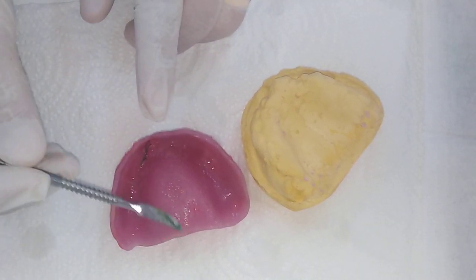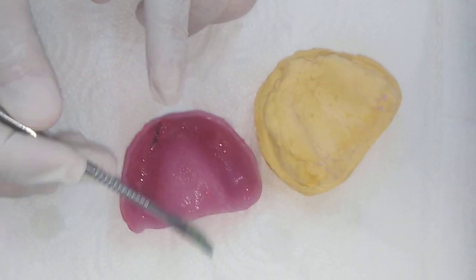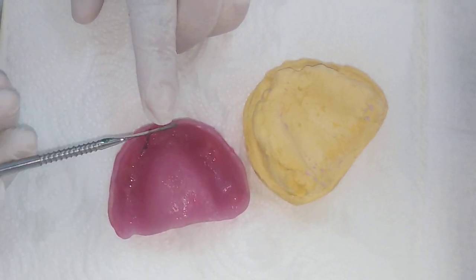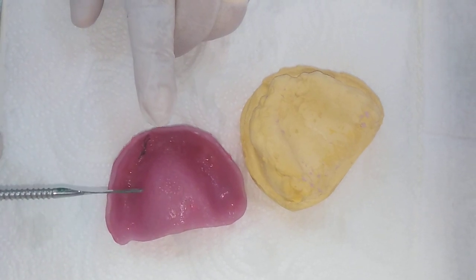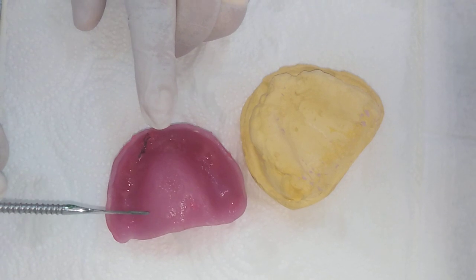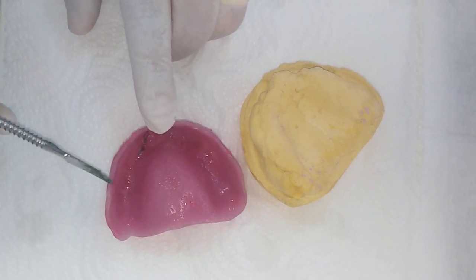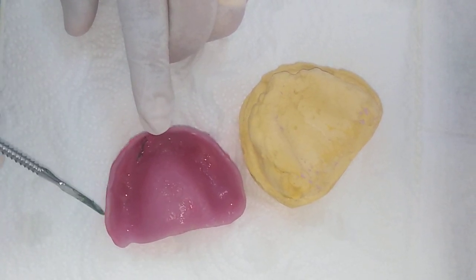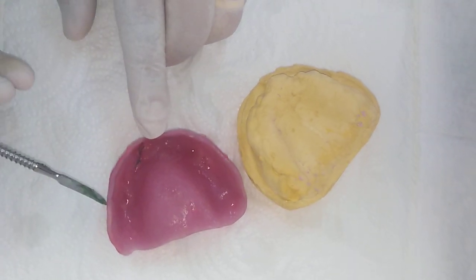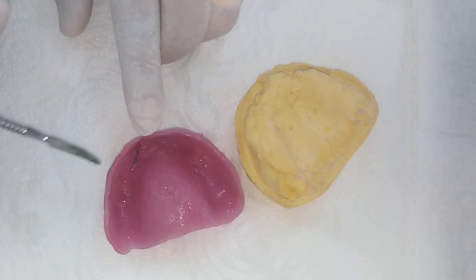Sixth, there is no post dam. Not having a post dam allows the ingress of air, so the negative pressure — the suction — is not acting. Seventh, the edges of the flanges don't occupy exactly the sulcus depth and width, so air will also be ingressing from these sides.